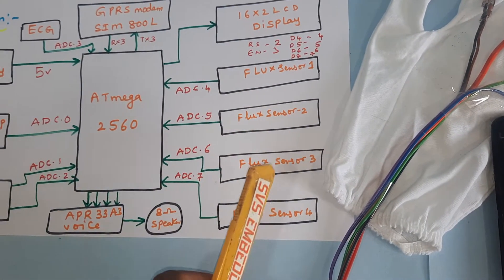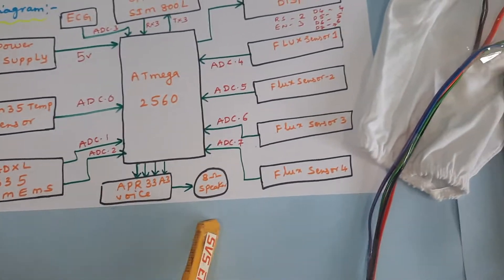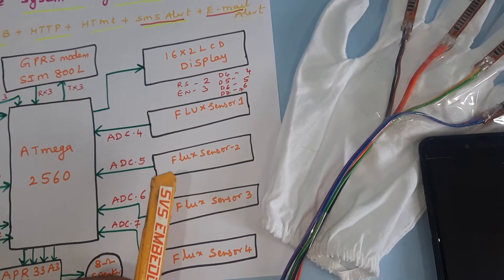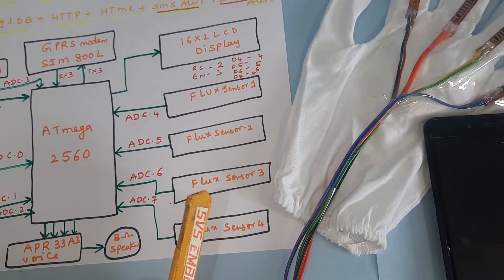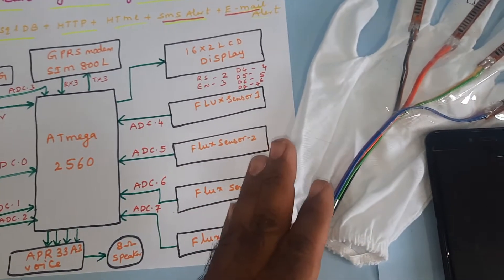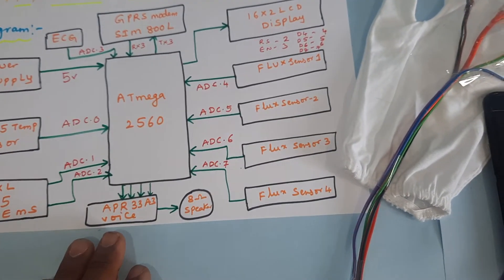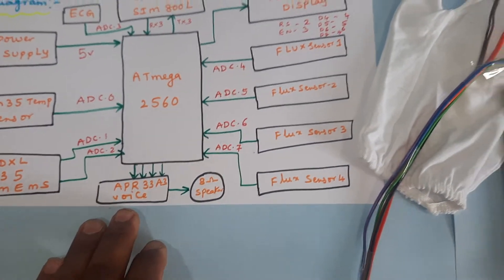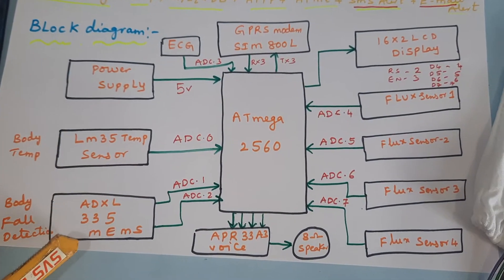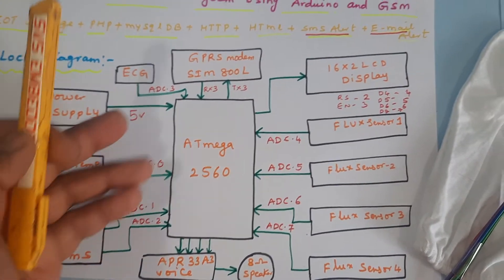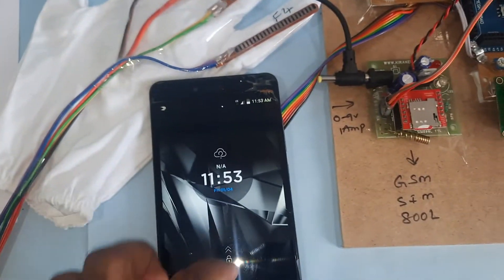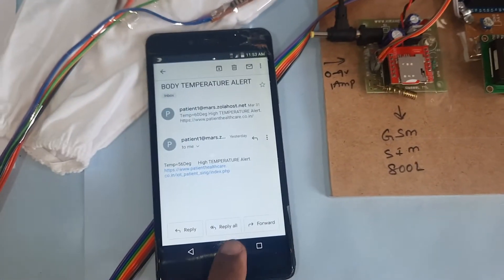Flex sensors one, two, three, and four provide voice alerts such as 'I need help,' 'I need food,' 'I need to go to washroom,' and 'I need medicine.' The voice comes from an APR33A3 voice module with an 8-ohm speaker. Temperature, ADXL, and ECG values are sent to the server at patienthealthcare.co.in.